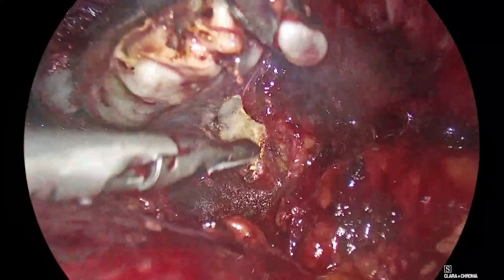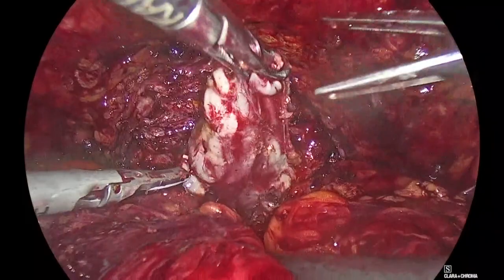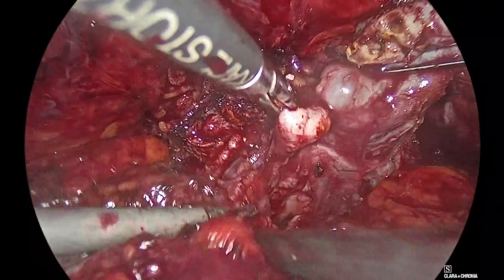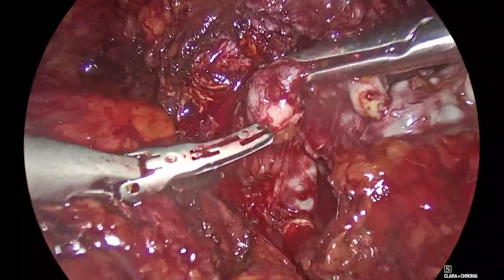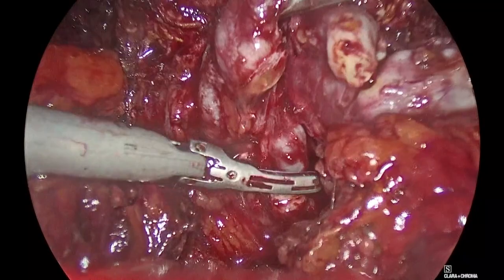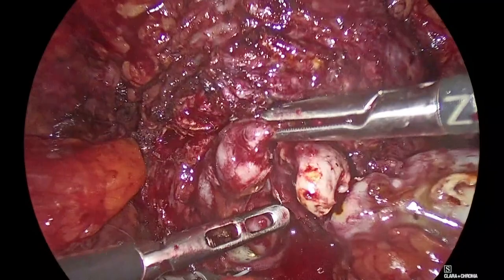Take this, Panagiotis, please. Your side, good. Now take the other one, the other one. You can see it. Good, so now we go on the other side. Traction here for you, for me, good. So take some time, it's very important. Counter traction by the assistant. Very important here. I mean, the assistant is important everywhere, especially in this kind of surgery.